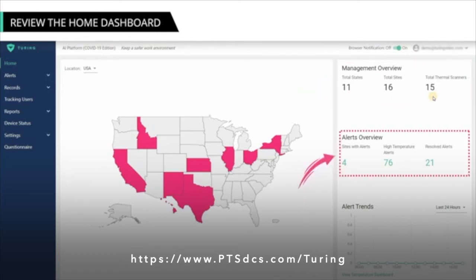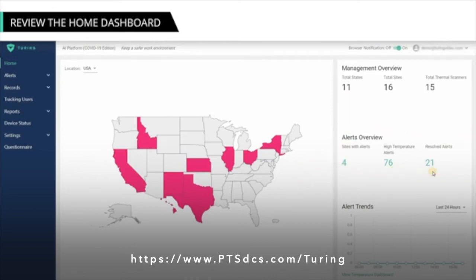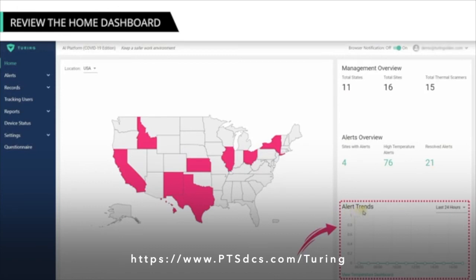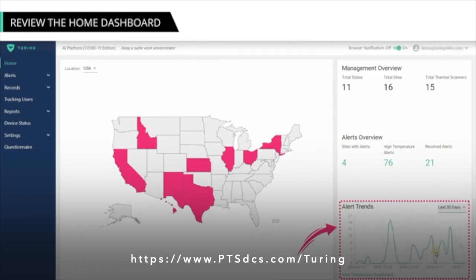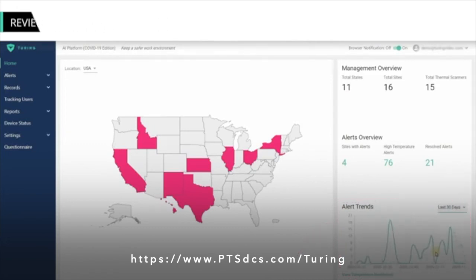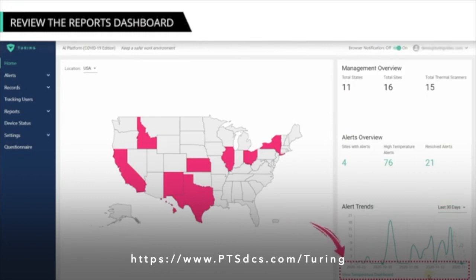Under Alerts Overview, you will find the total number of sites with alerts, the total number of cases with high temperature, and the number of resolved cases. The Alert Trends section allows you to filter data for a required period and understand the alert trends, helping you take necessary actions to resolve pending cases for a specific location. To learn more about the Statistics or Reports Dashboard page, you can click the View Temperature Dashboard link, or access the page from the Dashboard option of the Reports menu.